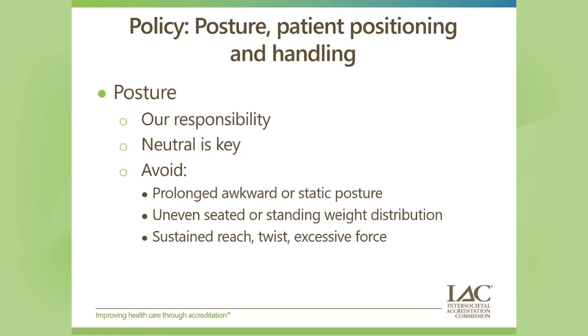You may not realize that when you're scanning, you put your weight on your left leg or your right leg if you're standing, or you lean to one side more than the other. And so doing that self-evaluation when you're in front of that patient throughout the exam is really important.